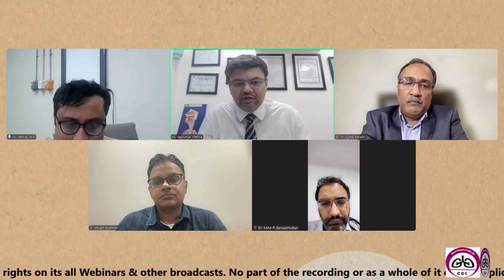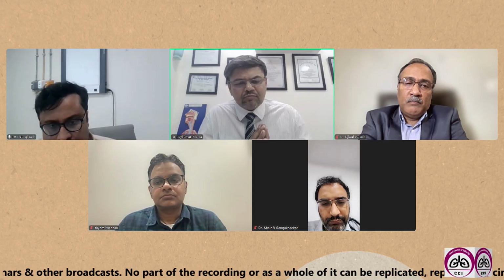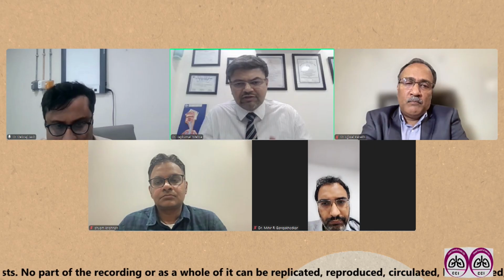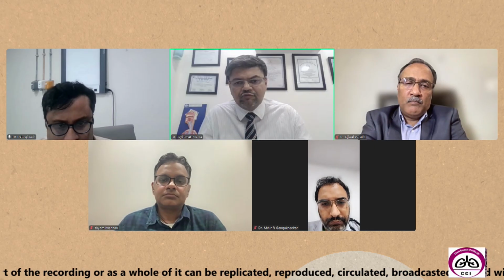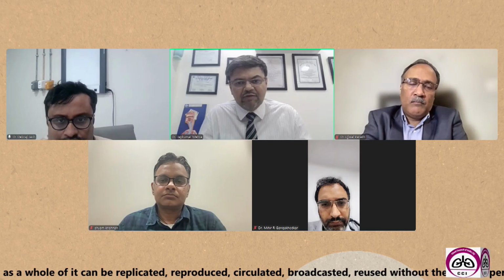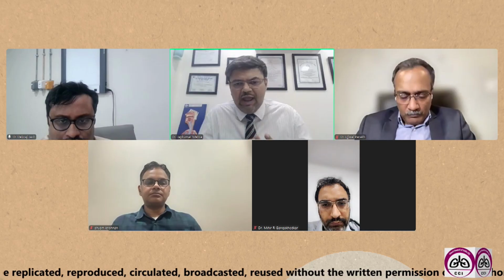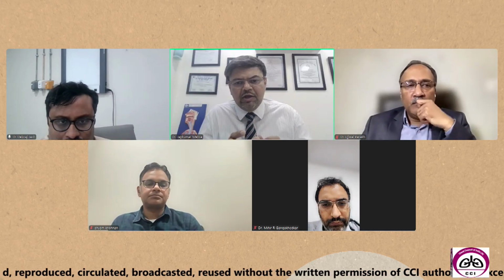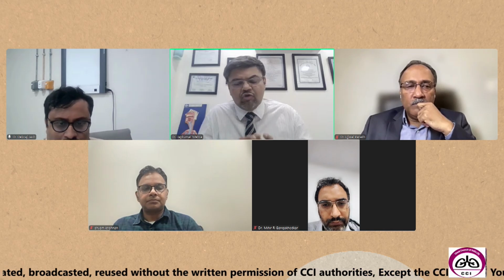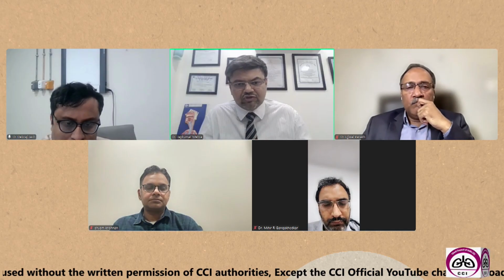We have an anesthetist by our side. We give a lot of time to understand the EBUS morphology of the lymph nodes. Although a CT or PET scan may reveal, say, a subcarinal or right lower paratracheal node, which is an easy target, we still see whether there are other lymph nodes with peculiar characteristics or any other EBUS findings. Based on that, we take our time, and we measure the size of the lymph nodes, the presence of, as I mentioned, the central hilus structure, the coagulation necrosis sign, and where to avoid, particularly the vascularity of adjacent structures.